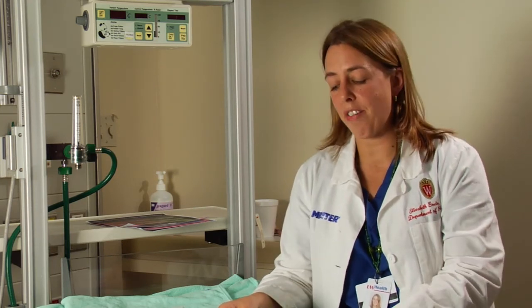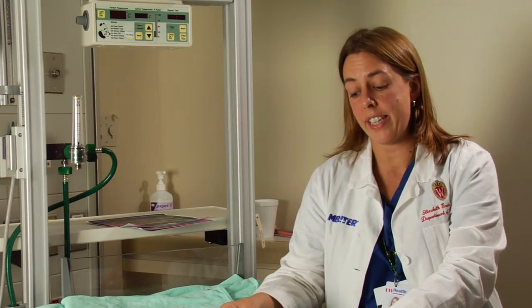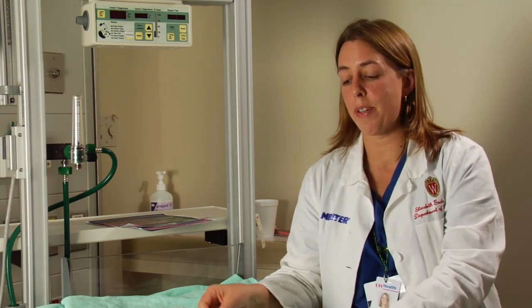There are 4 circumstances when we would ask you to call the Wisconsin SHINE project to provide additional information. There is no blood card available to report the pulse oximetry screening results. The baby fails the pulse oximetry screen, or the baby is known to have or suspected to have critical congenital heart disease by prenatal ultrasound or by physical exam prior to the pulse oximetry screening.